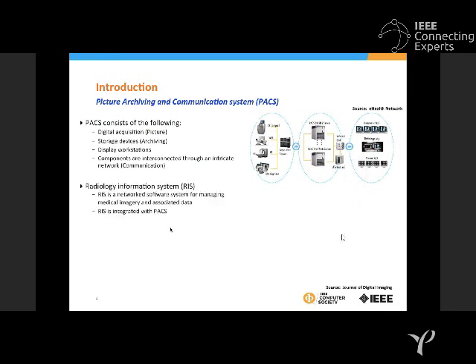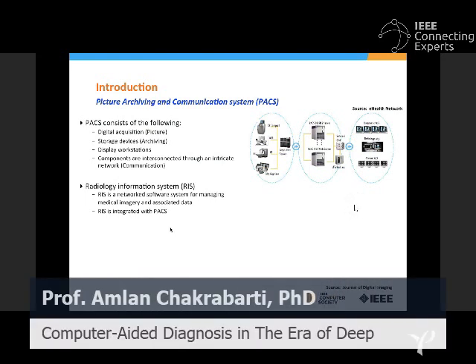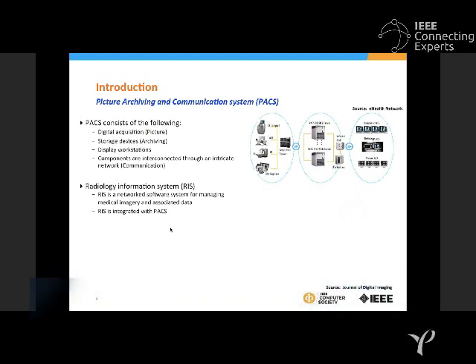With this PAC system, we also have to understand that there are very standardized information storage systems in terms of the database of images we are storing, as well as the workflows which have been acted upon on these images.